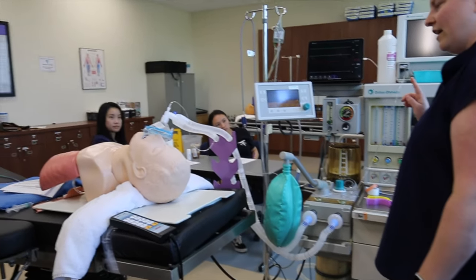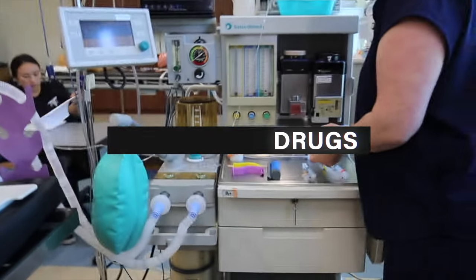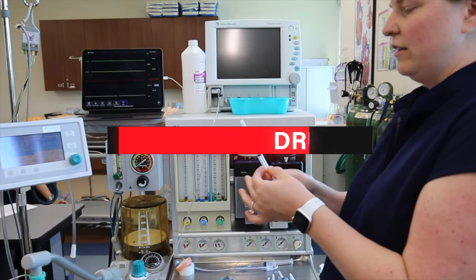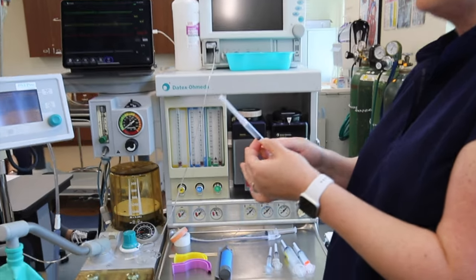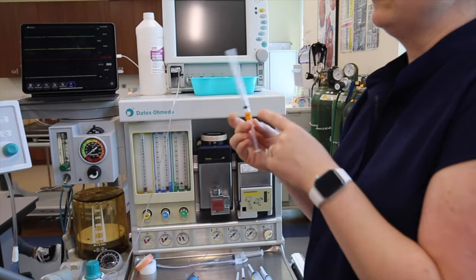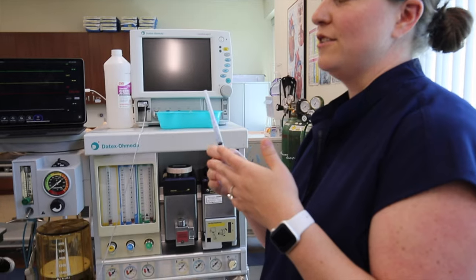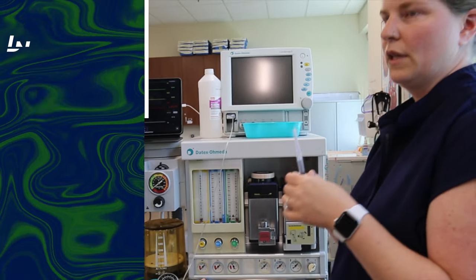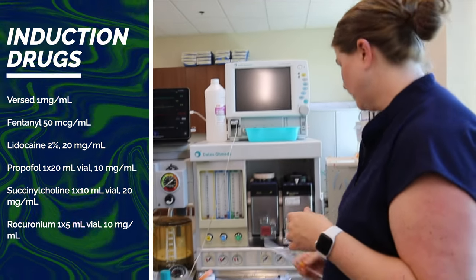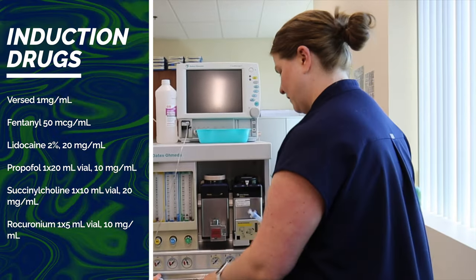So that was I. D is for drugs. So we have our induction drugs here on the anesthesia machine. My expectation for your exam is that you have the plunger pulled back to your anticipated induction dose. Your drugs need to be labeled with the drug name, the drug concentration, your initials, the date, and the time. You do not need to write the dose on here, just the concentration. Okay? I'll just do it on the exam.